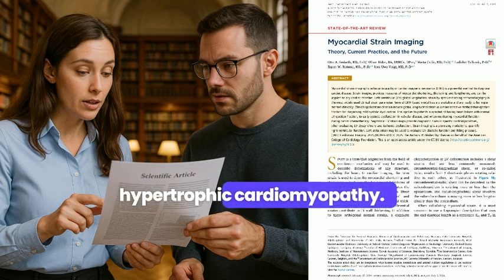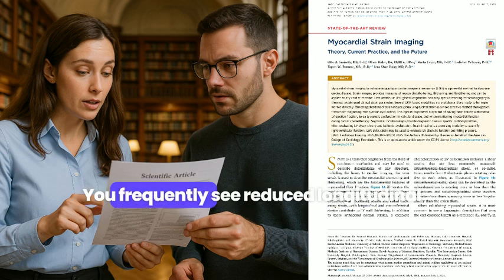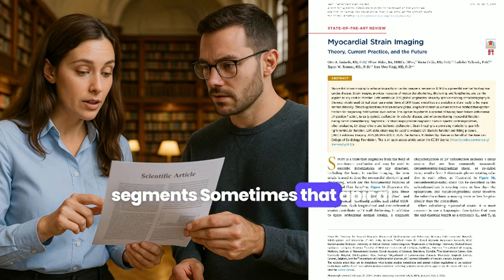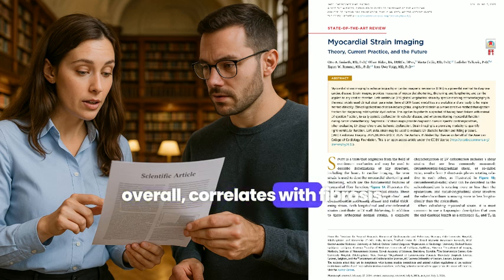Hypertrophic cardiomyopathy, HCM. Strain patterns are often very patchy, heterogeneous. You frequently see reduced longitudinal strain, especially in the thickest segments. Sometimes that apical sparing pattern. GLS is often reduced overall, correlates with fibrosis on CMR, and has prognostic value.